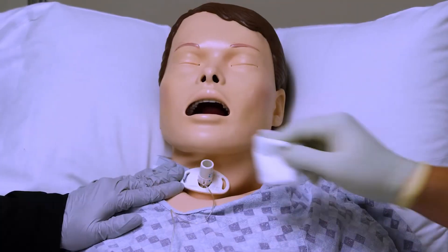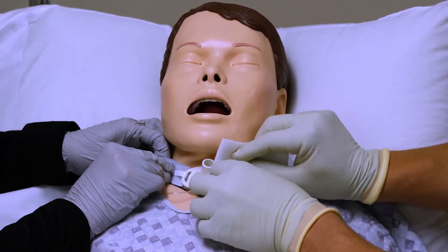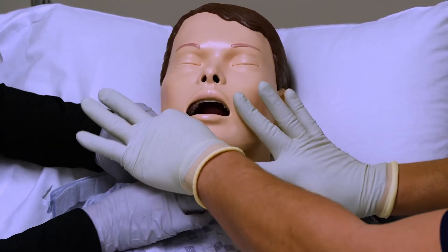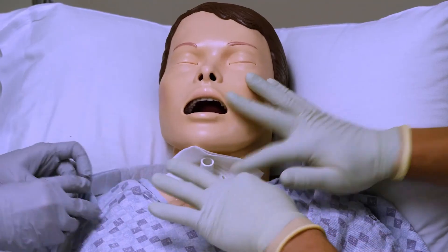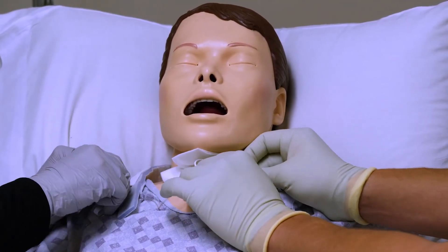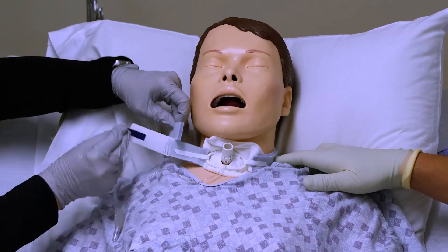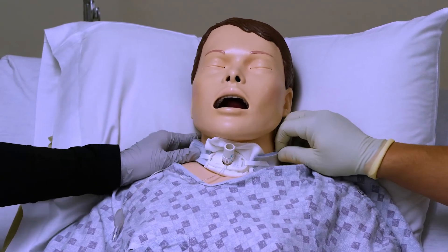Take the drain sponge — it's already got little slits on it — and you have to be a little clever about it. You don't usually want to take both sides off at the same time, but if you do, just hold on to it and shimmy it around so that it's nice and secure. This will help clean up a lot of the mucus that gets stuck around the trach. You're in the splash zone here, so do not put your face in front of that open hole. Continue to adjust the ties until it's a nice secure fit — you should only be able to fit about a finger in there. And that wraps up trach care.